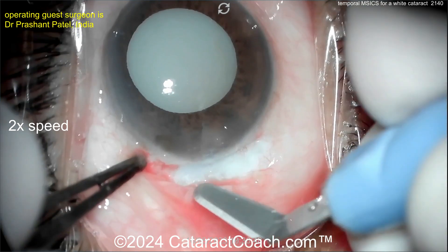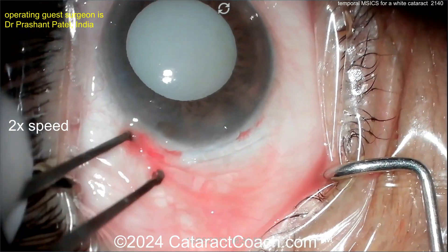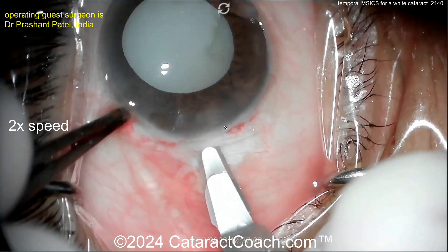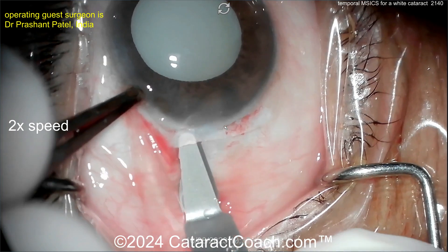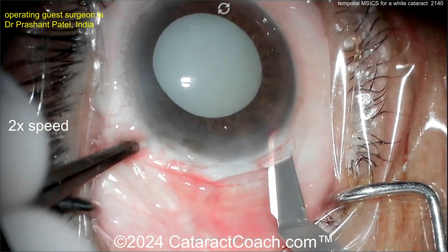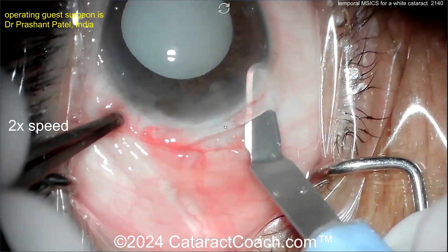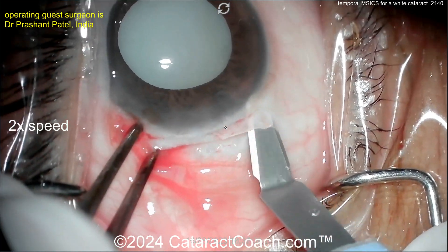Now the key for a white cataract and MSICS is doing a good incision. Using a crescent blade at about half scleral depth, a straight-line incision across. The key here is tunnel length — this is a shelved incision. Going in both directions, make sure you get a good grasp on the eye with those 0.12 forceps. Very nice — good tunnel length.